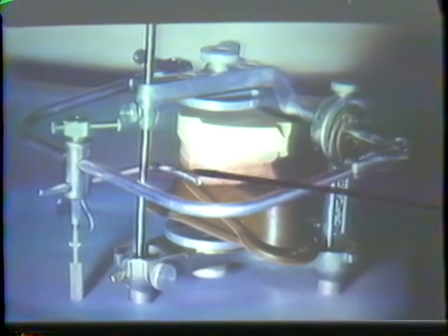So using just these two points and relating the axis in this fashion, we might make a facebow transfer without any other orientation. Now, when we get to the instrument, of course, we might adjust this on a horizontal in the instrument or any designated position on the arc of movement about this transverse axis.